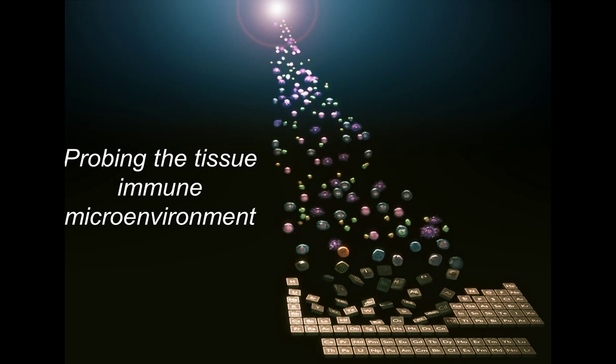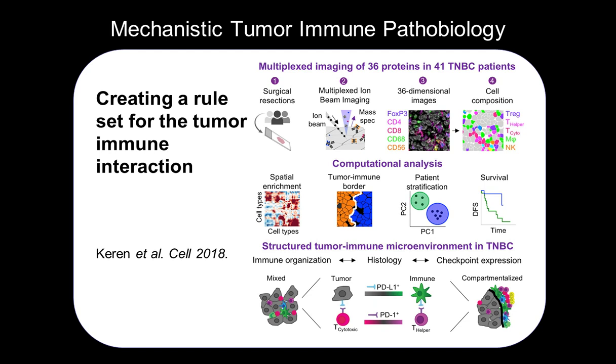So where has this taken us? Some people might have seen this paper or logged into a webinar that Mike gave a couple months back, but one of the really exciting early studies this enabled was, instead of looking at just a couple of patient samples and a couple of fields of view like we did in the 2014 Nature Medicine paper, a larger cohort analysis, specifically a retrospective study of triple-negative breast cancer. And bear with me, this is still leading to the neuropathology, but it shows how one type of instrument application leads to multiple downstream biological investigations.